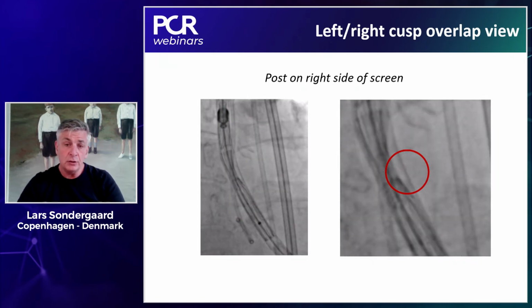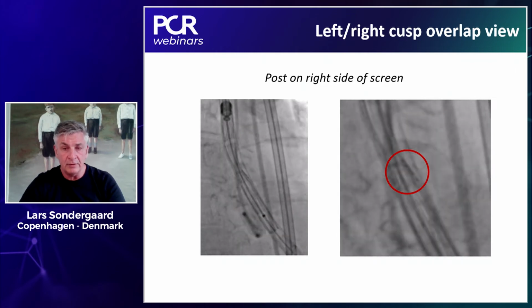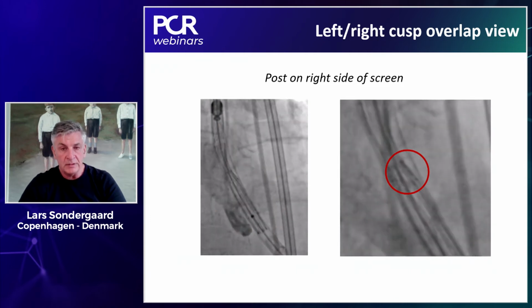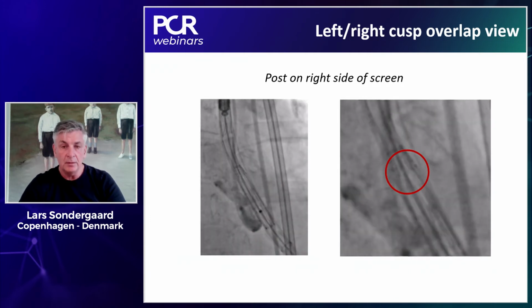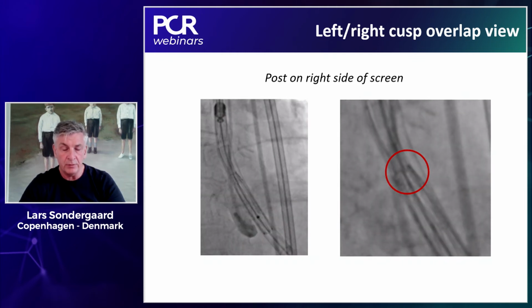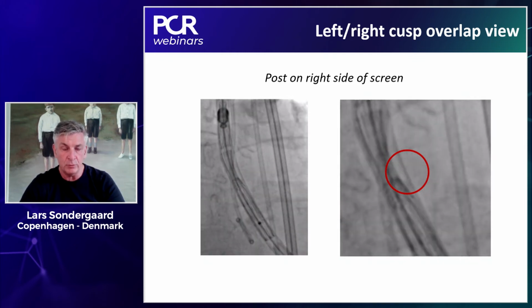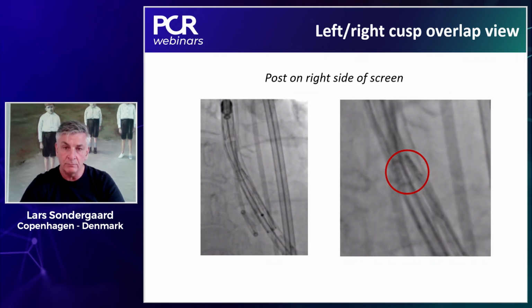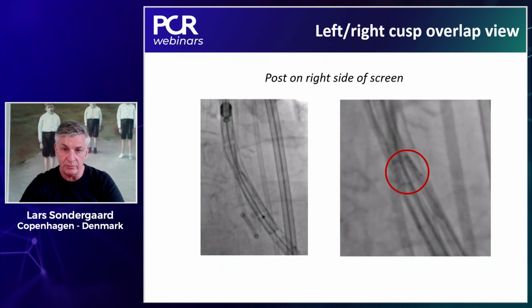And if you don't see it, you have to do some rotation on your delivery system. It's actually a very small movement. So if you do the calculation, you will see that going from severe commissural misalignment, with one of the leaflet posts in front of the coronary arteries, to perfect commissural alignment only asks for a 3 millimeter rotation of the delivery system. So very small.